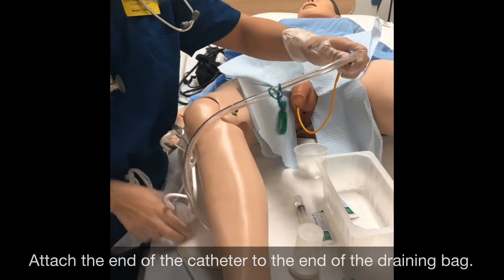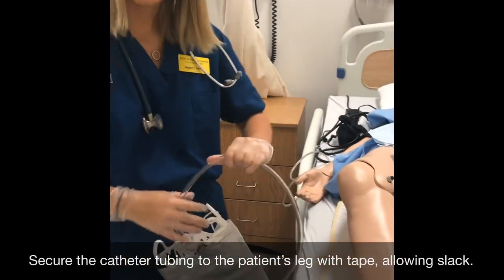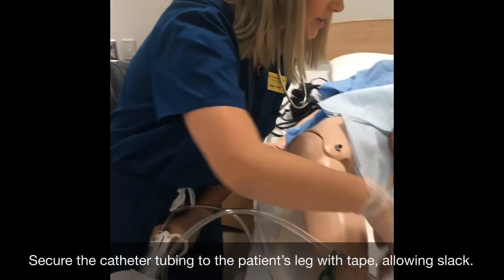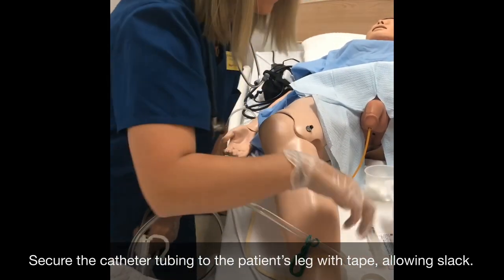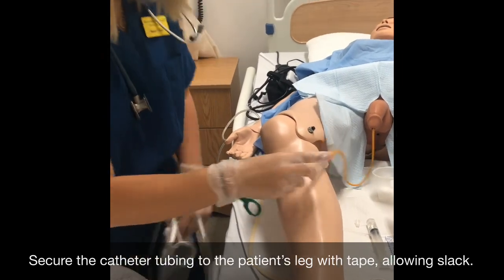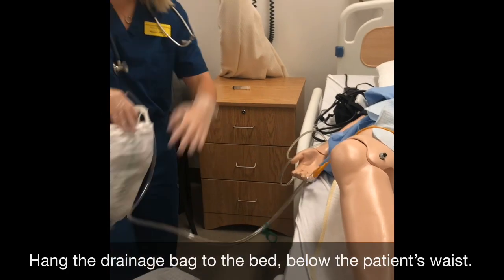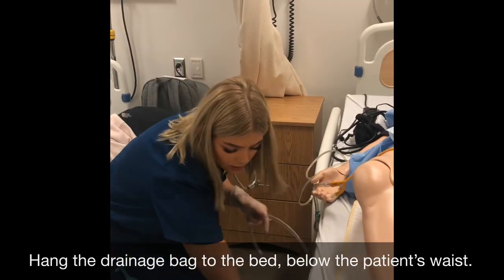Okay, and now that I have this inserted, I'm going to grab some tape and I would secure this to Mr. Mancini's leg, ensuring that there is slack. And then after that, I would make sure that the drainage bag is hanging below the patient's waist, preferably on the bed and not hanging on the bed rail.